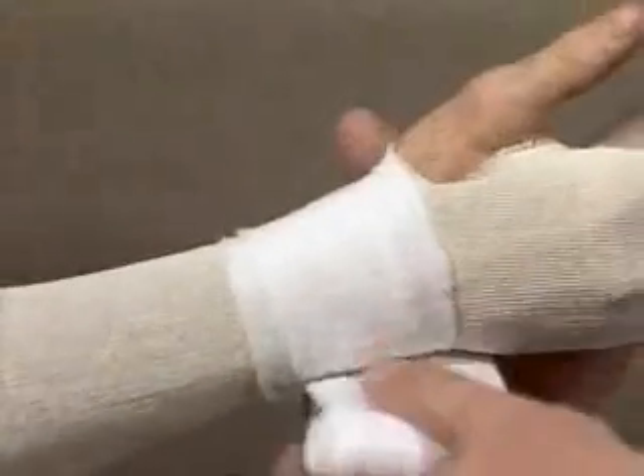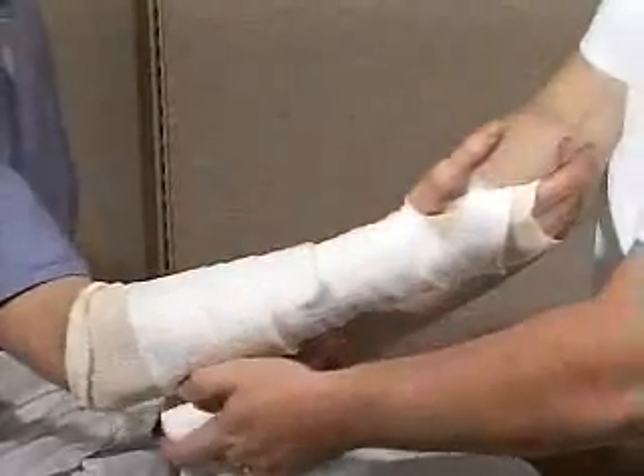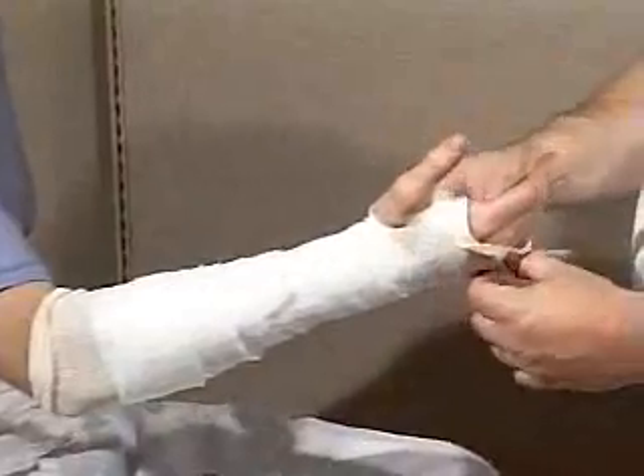Start wrapping the cast padding over the stocking end at the wrist. Two wraps of padding are required around the hand, partially tearing the material to surround the thumb base. A total of four wraps are needed at the wrist. Extend it approximately to two finger widths below the antecubital fossa. Fold down the end so that MCPs are free.